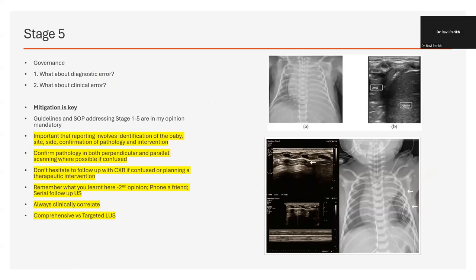And a simple example that I'd like to give you is putting a chest drain in. So you can, with an x-ray, say which side the pneumothorax is by looking at the x-ray. And experience says that whenever I insert a drain, whether that's a pleural drain for a pleural effusion or a drain for air, I will always bring the x-ray up. I will not actually put a drain in for a pleural fluid without actually doing an ultrasound. For a pneumothorax, I will do an ultrasound. Where time permits, I will always get an x-ray done. But more importantly, before I actually put the drain in, I will have that x-ray up on the system to make sure it's right side, right patient, and right approach.